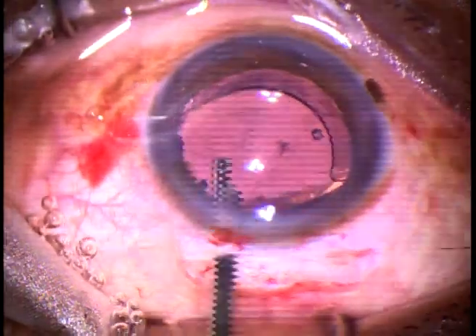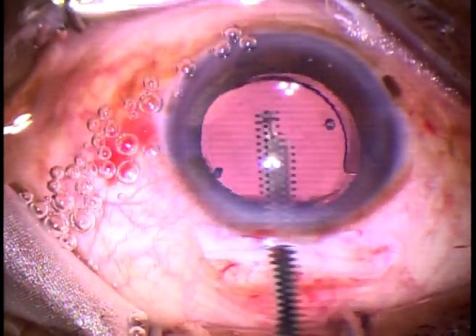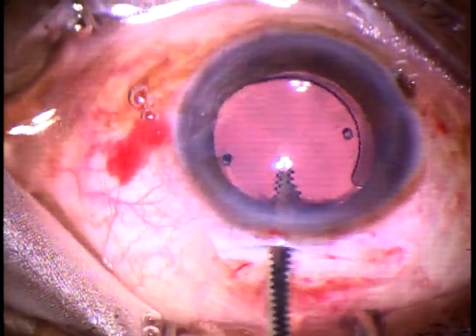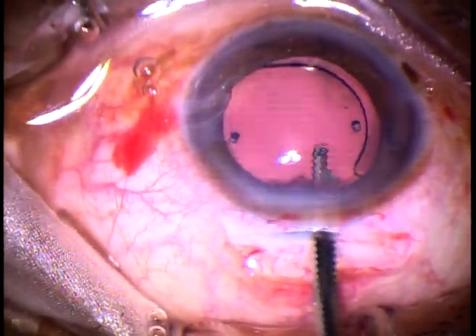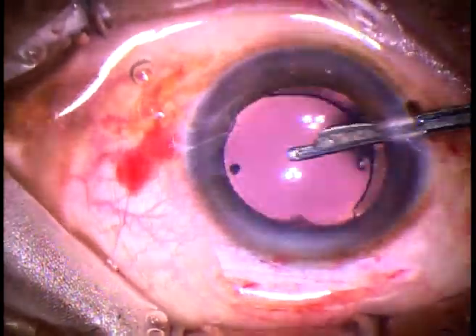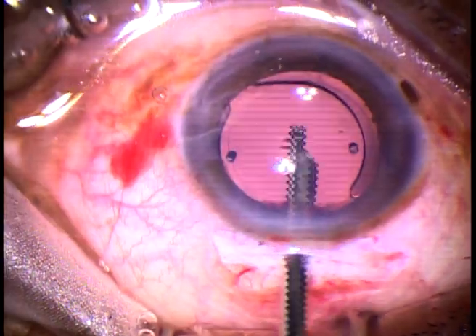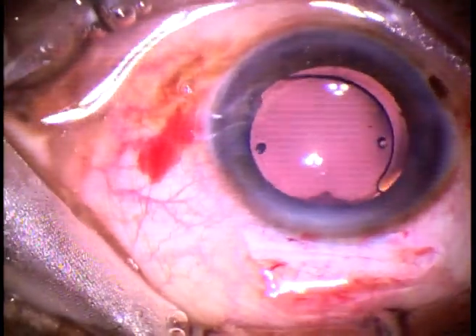The viscoelastic in the anterior chamber and capsular bag is now flushed out. First, visco from the anterior chamber is removed, then go behind the lens — it is not difficult — irrigate the bag so that visco from the bag comes out. Thorough cleaning of visco is very much essential to prevent post-operative rise in intraocular pressure. Give quality time at this moment; never hurry while cleaning the visco. Otherwise, learn to implant the lens under irrigation.